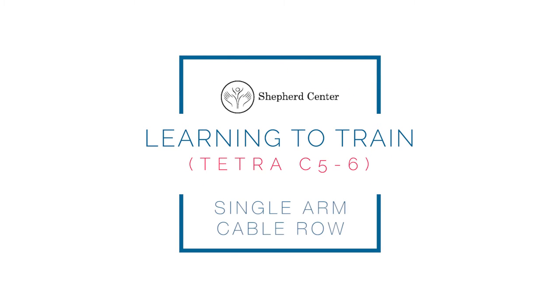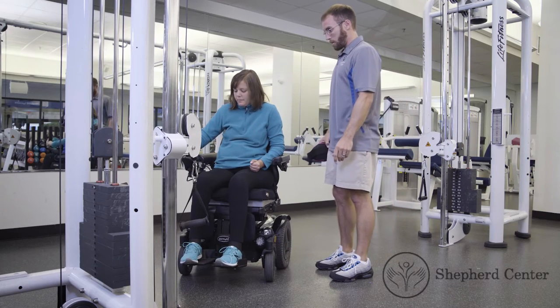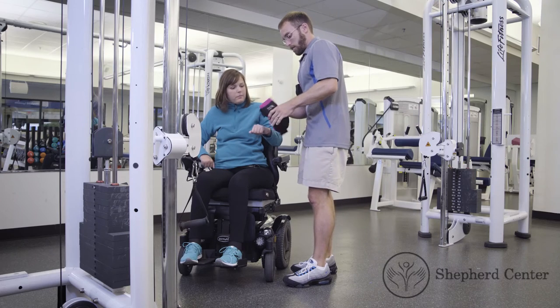Single arm cable row. Position the participant's wheelchair just in front of the cable system. Make sure the pulley system is just below the participant's chest.